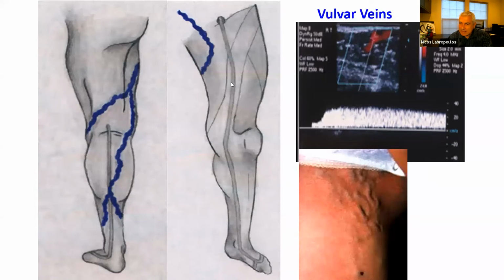And here some non-saphenous veins are actually far more common, and they don't have any particular topography, but they come in typically medial to the saphenofemoral junction from the pelvis, as you see here, right? There's a lot of varicosities, and you see all these big tributaries from the pelvis. You may think they are from the saphenous, but if you continue, right, they go all the way up to the labial area.